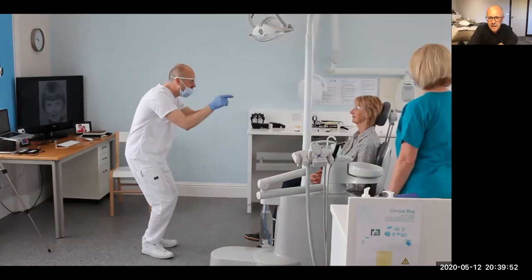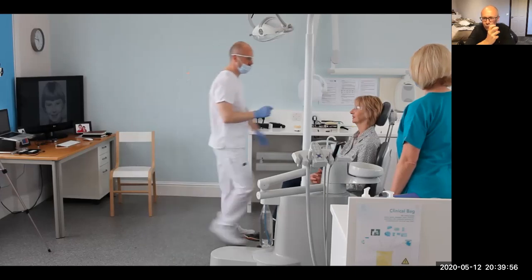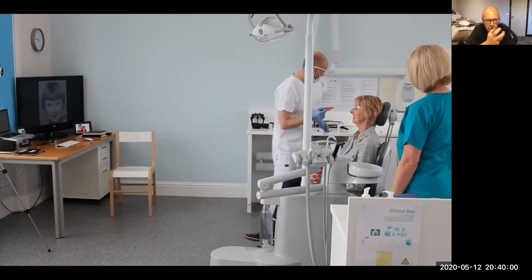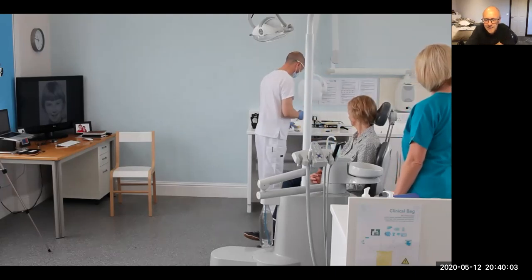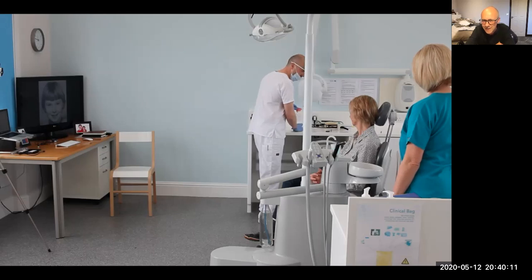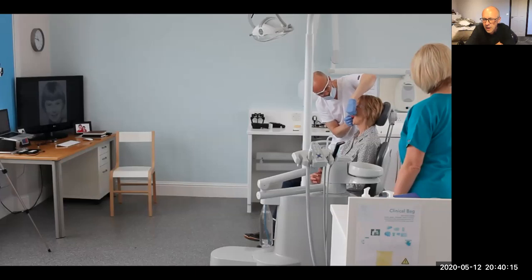And here we are, this is us at the registration stage, and like I've mentioned all the time, what Claire and I are trying to do is visualize Julie, our patient, as if they had teeth. We want to visualize what she would look like if she had natural teeth. And the dentate pictures are key to this. And this is where Claire and I just have a dialogue.